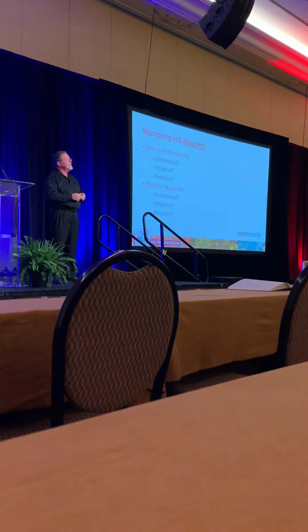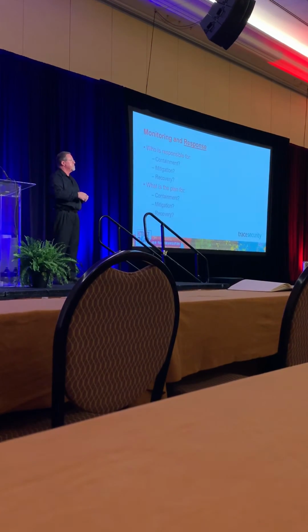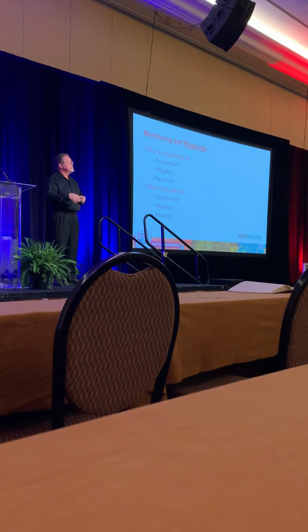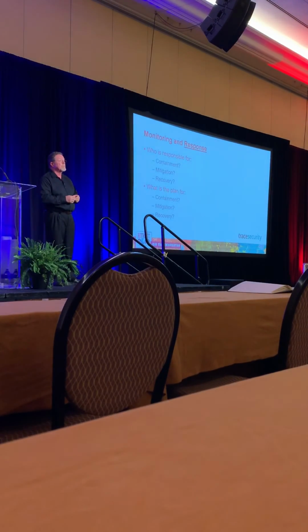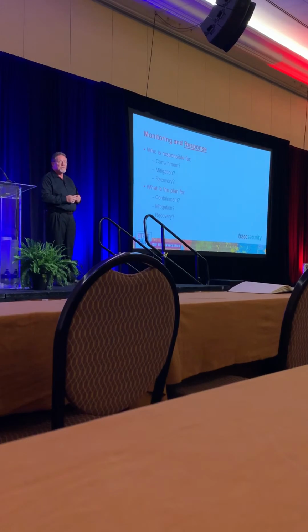Containment, keeping it from spreading, mitigating, making sure that it can't infect other systems through some type of patch or modification to the system, and then eventually recovery back to a normal operating system. So once you determine who's going to do it, you determine some procedures to do it, that essentially becomes your incident response plan. And so those elements are essentially the ones that are involved in device security.